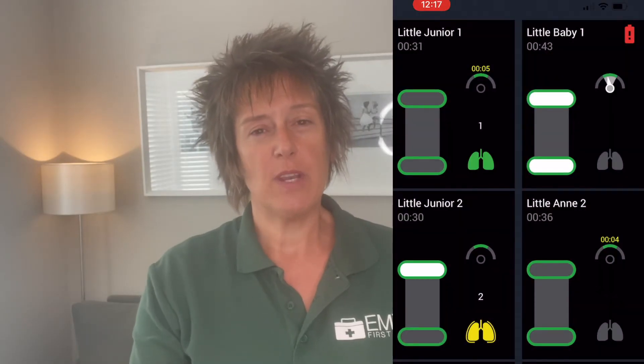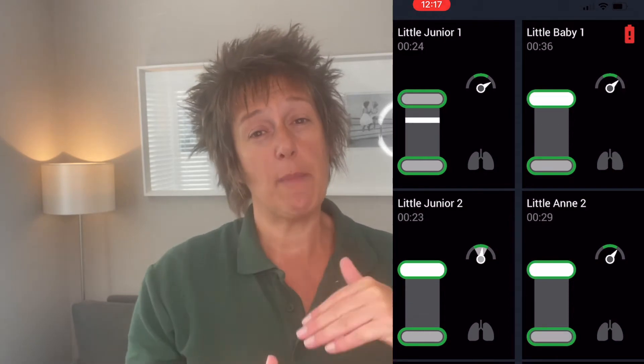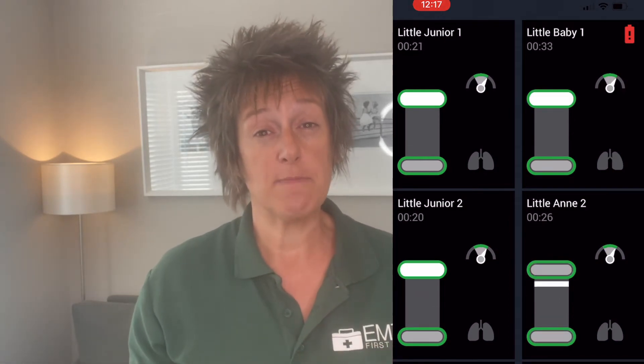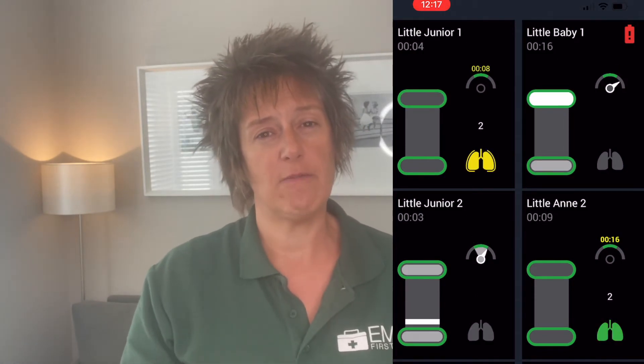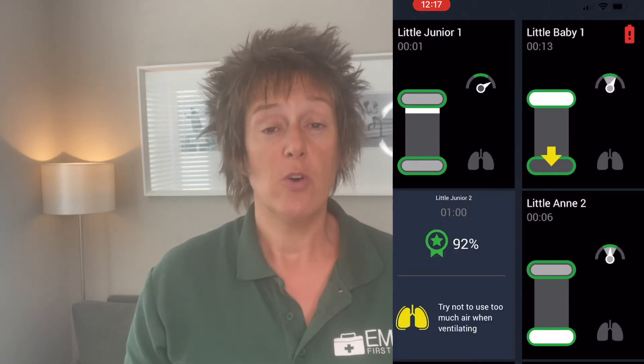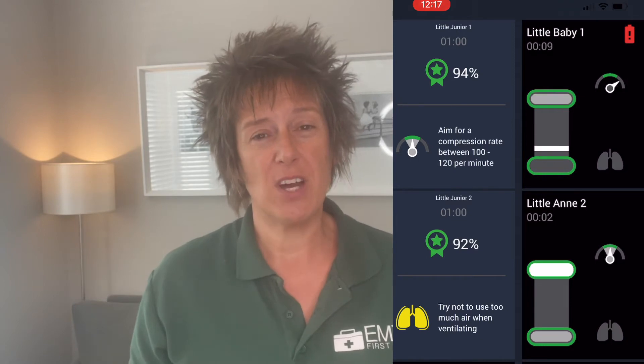This icon on screen will show learners if they're pushing deep enough, if they're coming up enough, and if they're going at the correct speed — which is 100 to 120 beats per minute. It will also show how long they are off the mannequin, so how long it takes them to do rescue breaths. Ideally you don't want to take more than five seconds to do rescue breaths, so it gives a timer, and it tells you how effective the rescue breaths are — whether inflating too much, not enough, or whether any air went in at all.